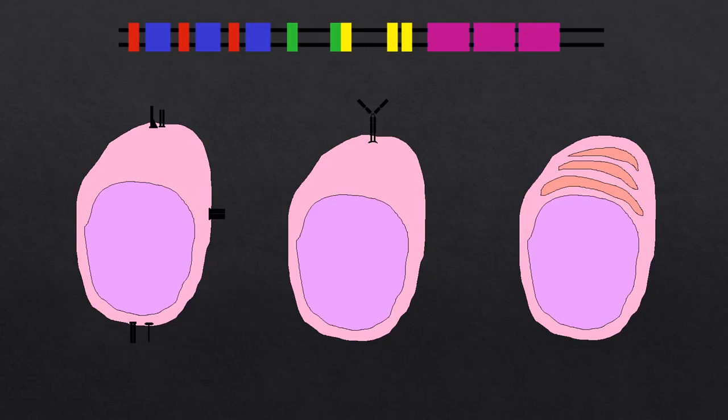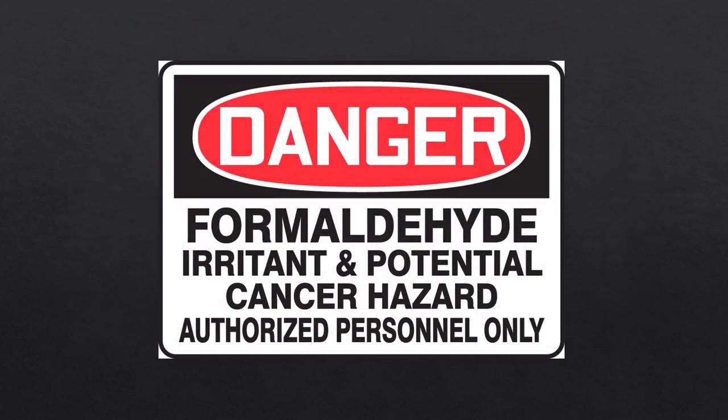When producing polyclonal antibodies, animals have professional antigen-presenting cells that recognize the target molecules as a pathogen and present it to helper T cells to begin the production of antibodies. The production of monoclonal antibodies takes this one step further by creating an immortal plasma cell line. Our understanding of continuous and discontinuous epitopes allows us to theorize why cross-linking proves to be an issue for IHC during fixation. Furthermore, it also allows us to understand why unmasking epitopes is so crucial to IHC.